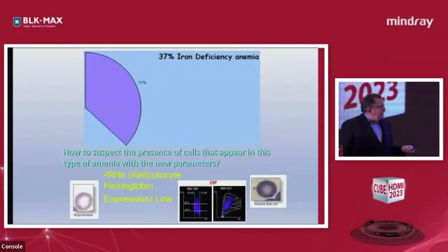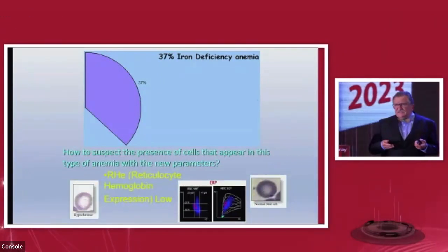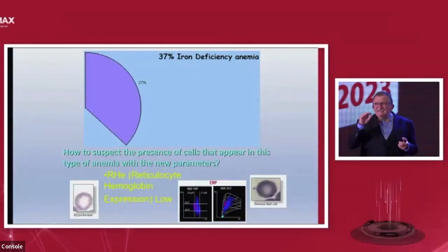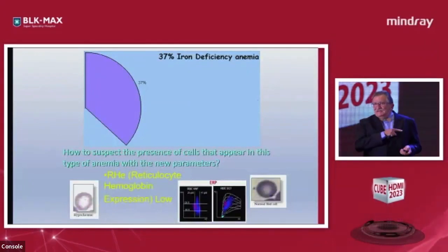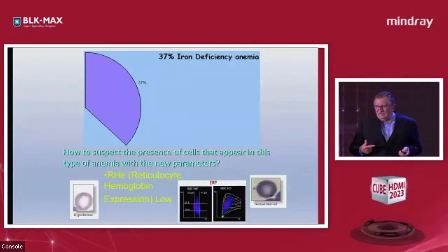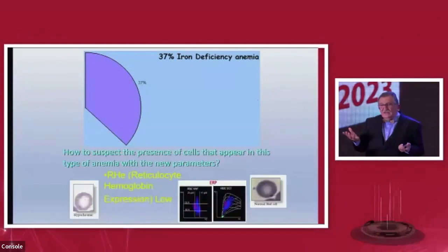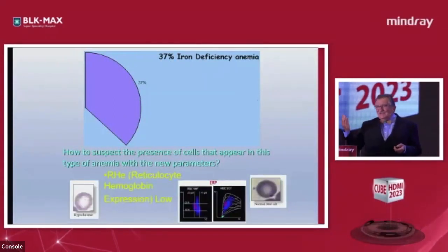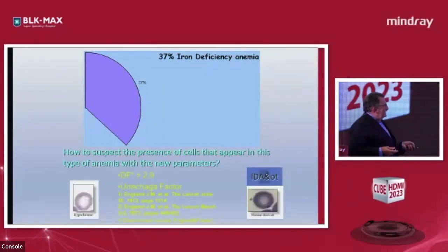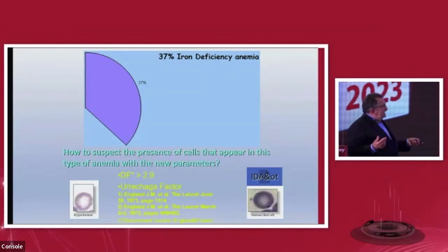RHE, reticulocyte hemoglobin for sure, and that is important because in these cases of latent iron deficiency, you may find the volume is still 80, 79, 81, but the reticulocyte hemoglobin is low. The new reticulocytes that are produced have hypochromia, but all the others not, because the red cells have an average life of 120 days. I am going to go fast because I want to spend my time. Of course, there are discrimination factors from England and Fraser to differentiate thalassemia and iron deficiency.